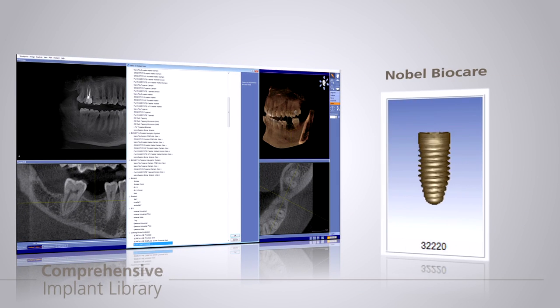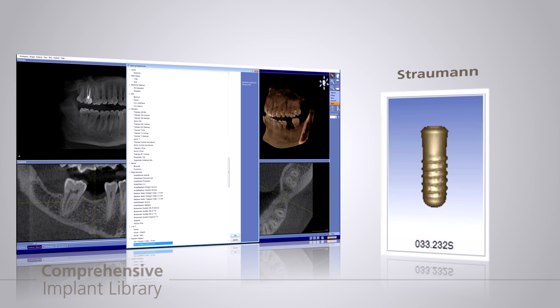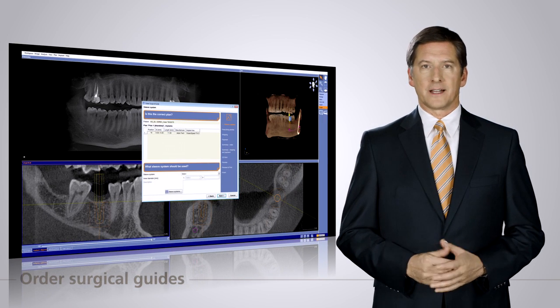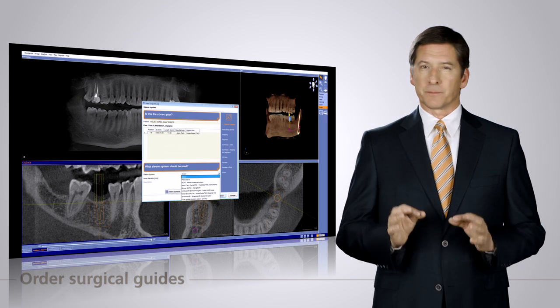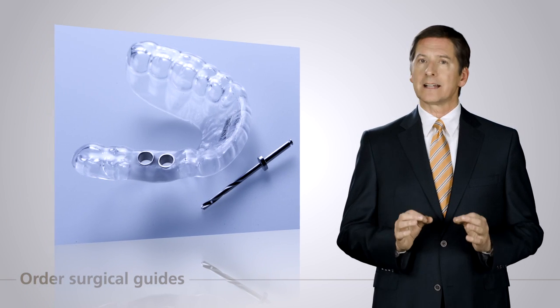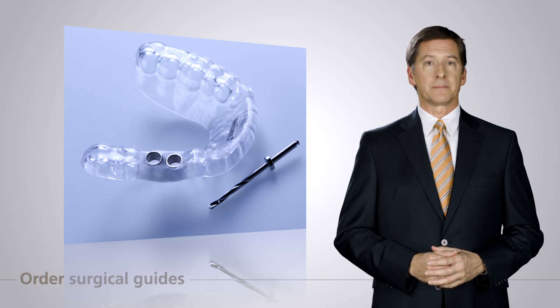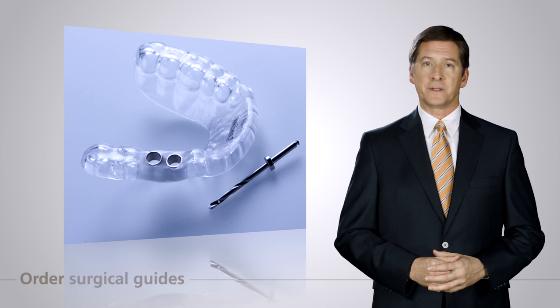With a comprehensive library of implants, the software allows you to plan the implants of your choice. You can order precise surgical guides directly in the software. The precision of the CCAT surgical guides allows implant placement exactly where planned, enhancing your ability to place implants accurately with ease and speed, providing a fantastic final outcome with maximum convenience for the patient.